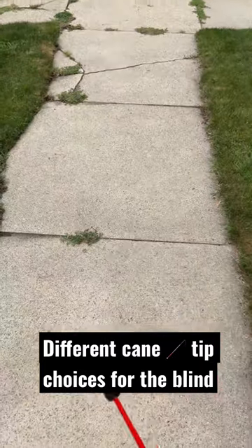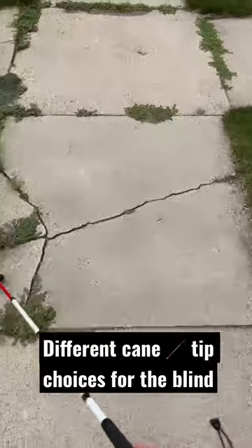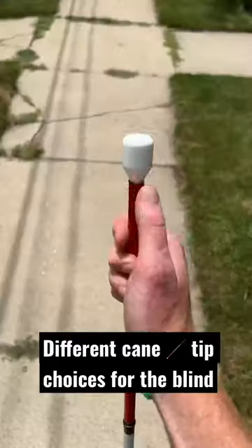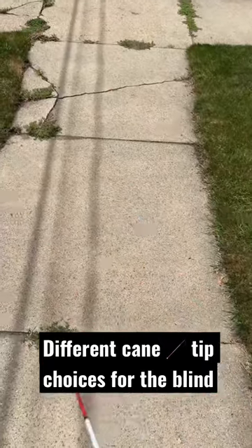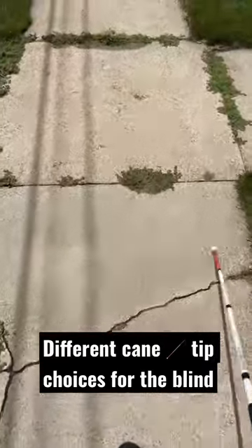Hey there, I'm an orientation and mobility specialist for the blind and visually impaired, and this is a short demo of just a few of the many different types of cane tips that are available. That first one was a Rover freewheeling cane tip. This one here is a marshmallow cane tip.